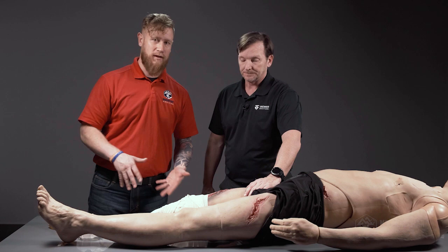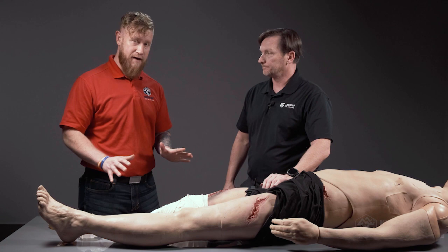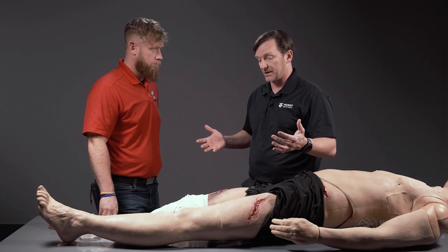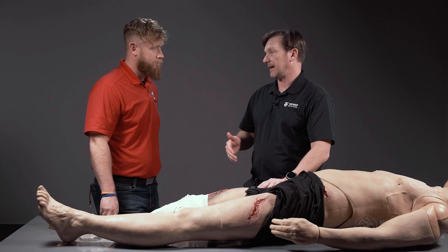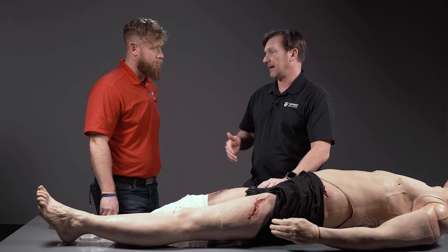You can see he wasn't moving quickly, but he had this casualty pretty much wrapped up in less than a minute without really hustling. So take your time, take a deep breath — you have a little bit of time to get this stuff in place. The only part where time is really working against you is getting that tourniquet on. Every red blood cell you save carries more oxygen to the brain and vital organs.